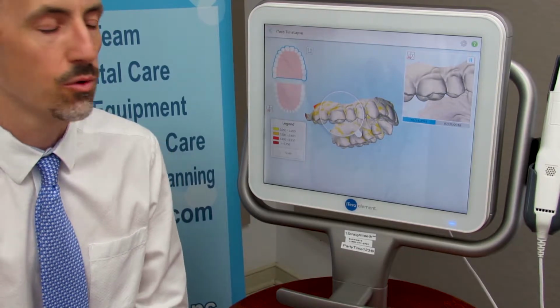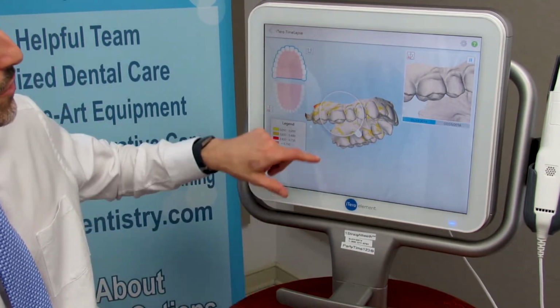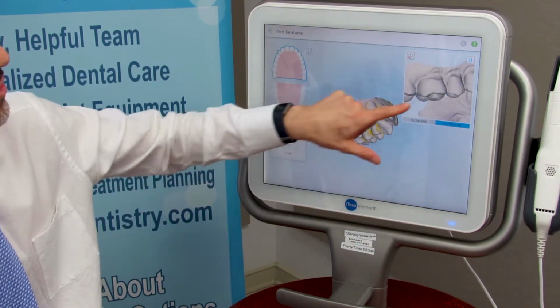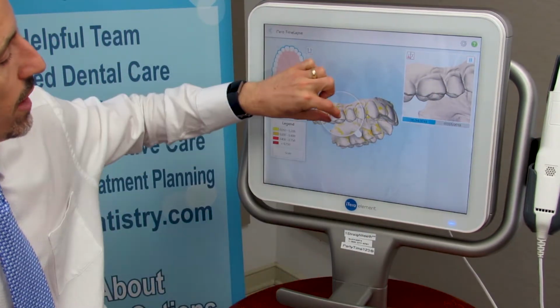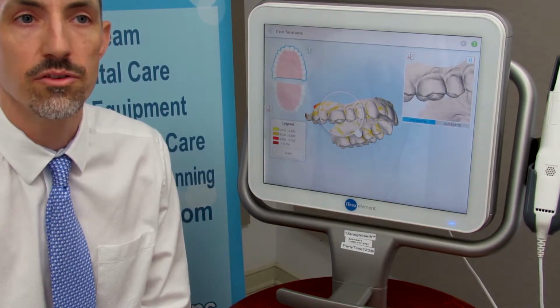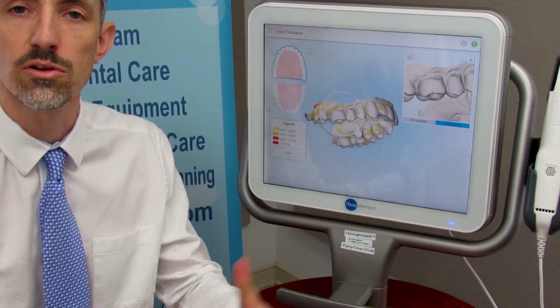With the digital scanner, we're able to compare over time how your teeth wear and if there's changes in areas of recession. So for example, this is my mouth. This was a scan that we did in May of 2018, and about 2 months later, you can contrast that. 2 months usually isn't a lot of time, so I'm not seeing a big change. But if you're grinding your teeth or you have recession, we can track this over time. Some of the other things that's very nice is when you're doing Invisalign, we can track how your teeth are moving if things are tracking according to the way we planned.